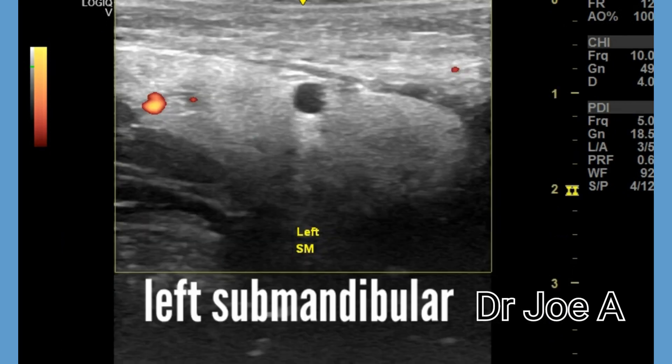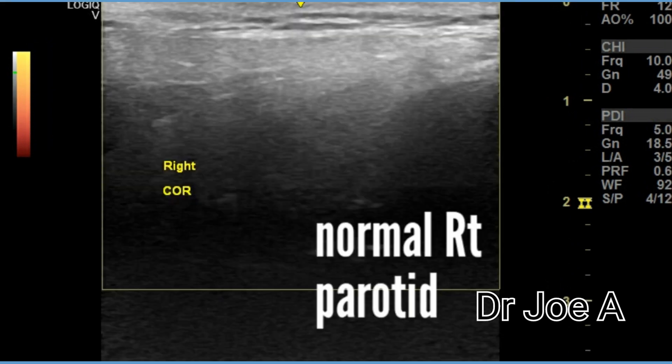In this patient, the left submandibular gland also appears to be mildly inflamed. The normal right parotid gland is shown for comparison.